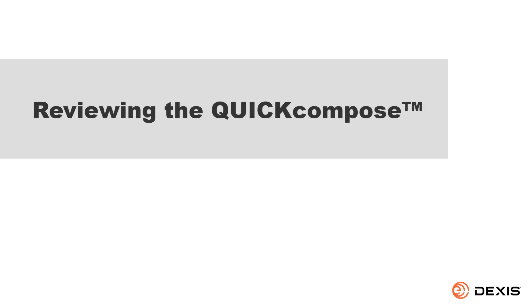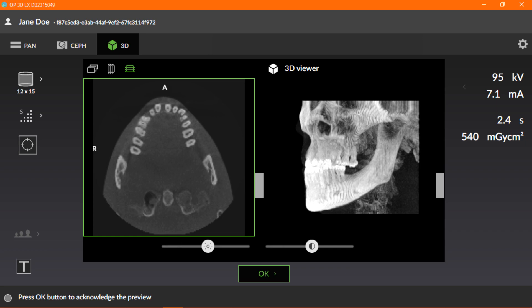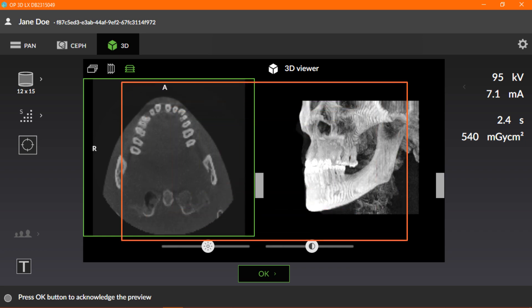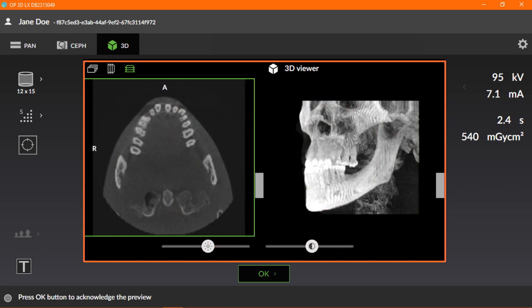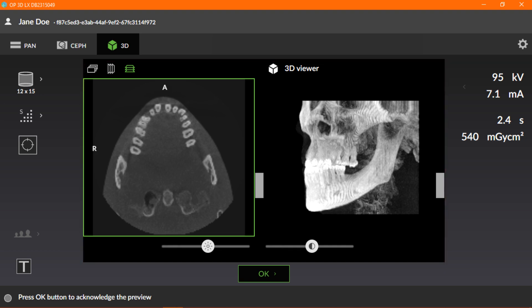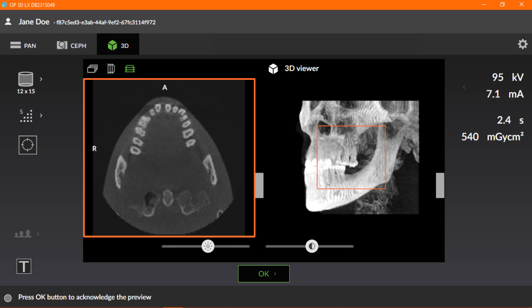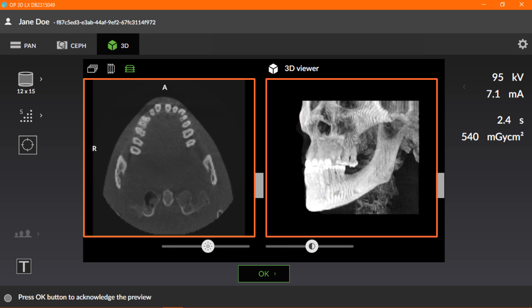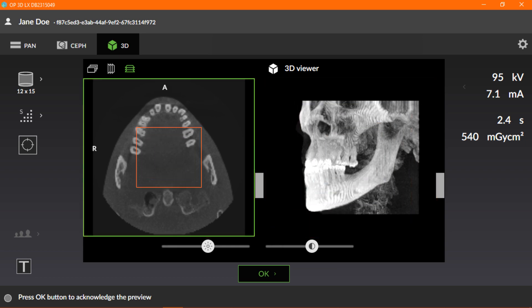Reviewing the Quick Compose. First, we'll see a preview of your 3D image. The preview is called the Quick Compose 2.0. This low-resolution image is shown on the GUI after the image has been taken. The Quick Compose is divided into two sections, the slice preview and the volume preview.